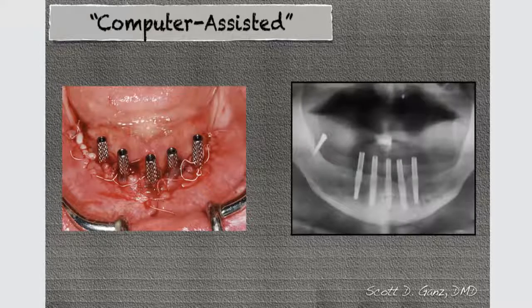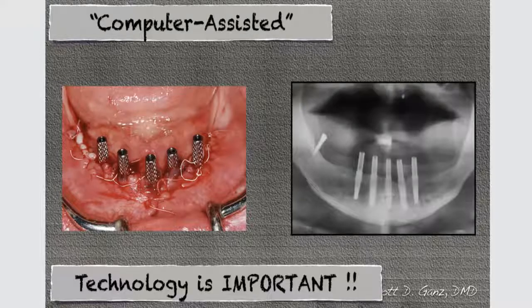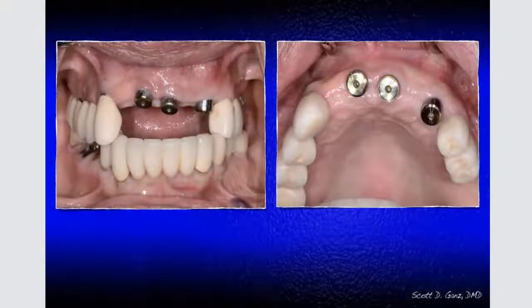and then we will load this case with a conversion prosthesis from the patient. So we are using our brains, and our brains are going to be used in conjunction with some of the technology that is, of course, computer assisted. And so technology is important, and this is really the basis and the foundation for proper diagnosis and treatment planning.